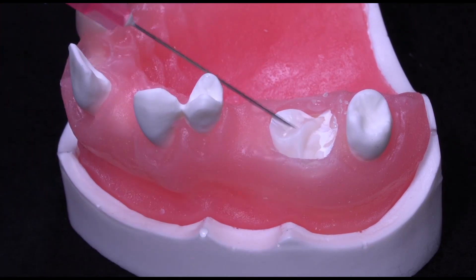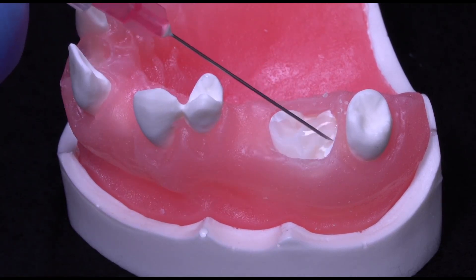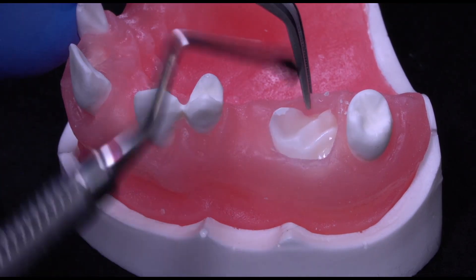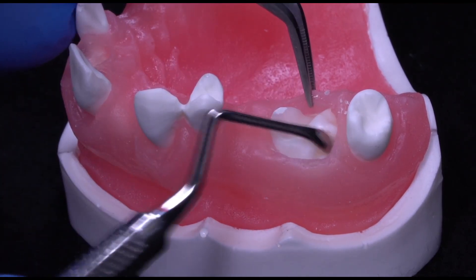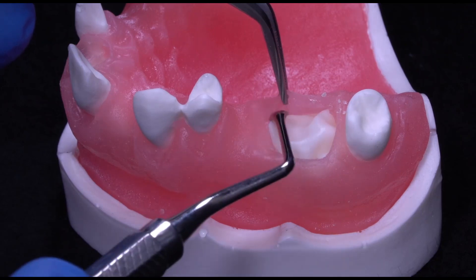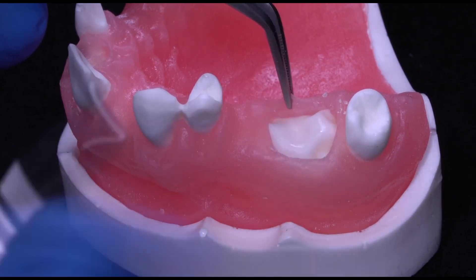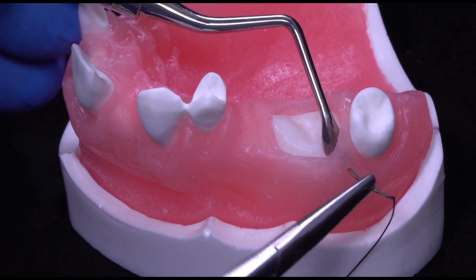Hydrating the membrane improves its manipulation. It is important that the membrane lay flat and nicely adapted to the defect.